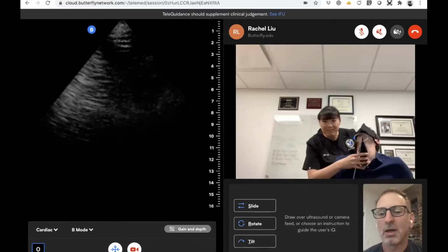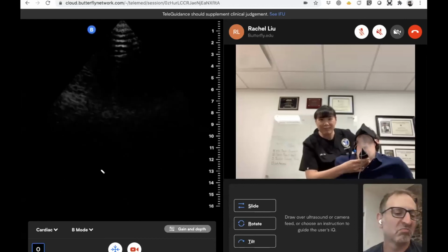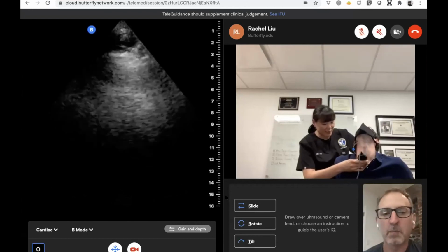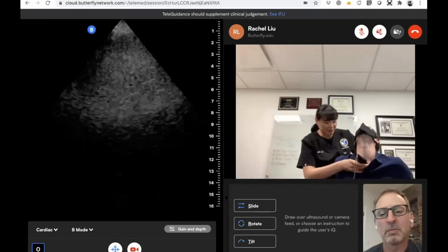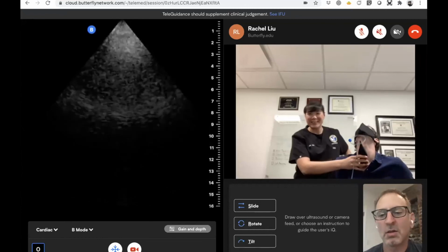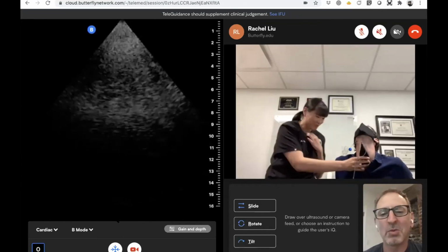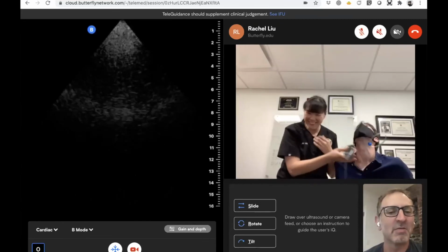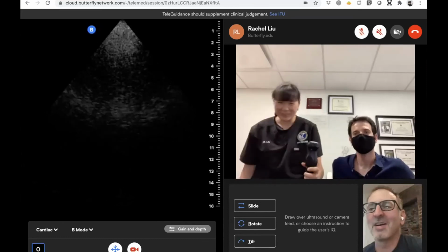No, I'm not getting a great image. I get it very superficially, but I can't see the arch down there. We don't want to put too much pressure right on his neck and have him pass out on a live webinar. It'd be embarrassing for everyone.